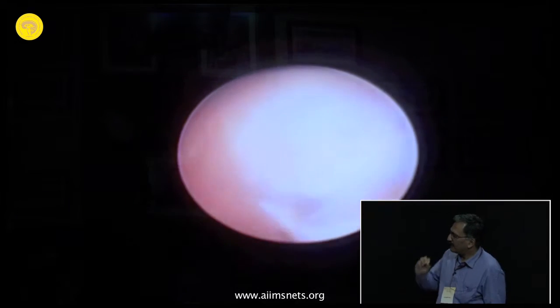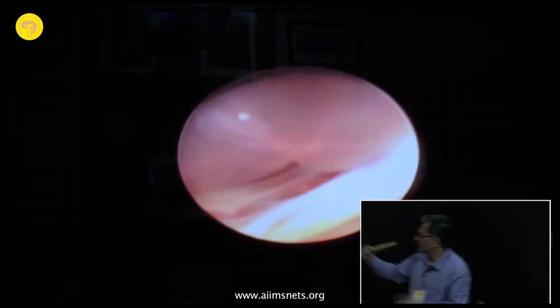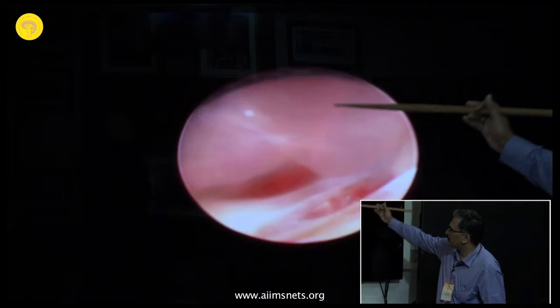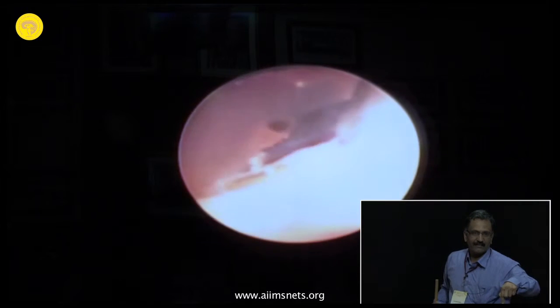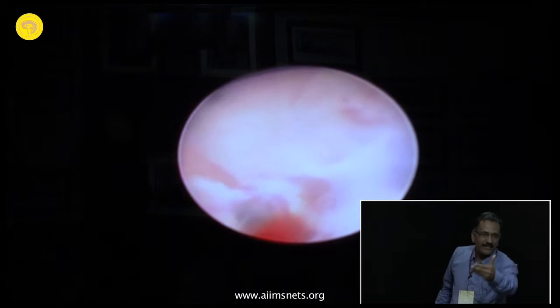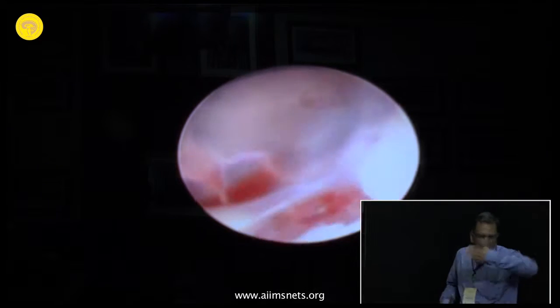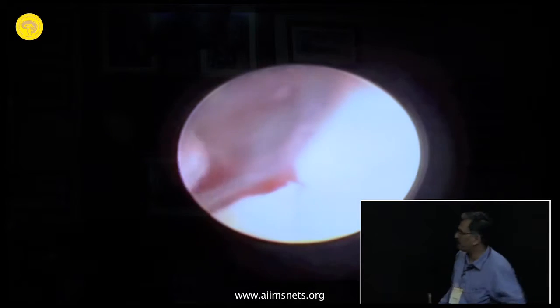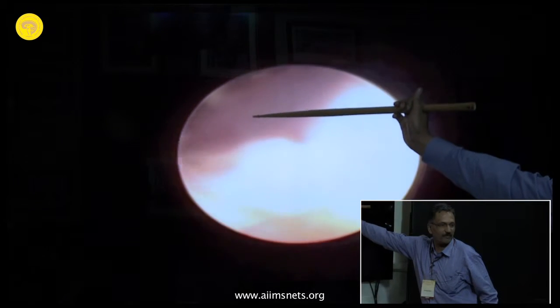And the other thing is, sometimes it's all very thick. Here you're just getting the brainstem, and this is all very thick. So you just palpate the dorsum sellae. Once you palpate the dorsum sellae in such a situation, then you can go anterior to it and go to the premammillary membrane. Just posterior to it, get the premammillary membrane. So you can now see the mammillary bodies, you can see the basilar artery, and this is the membrane.